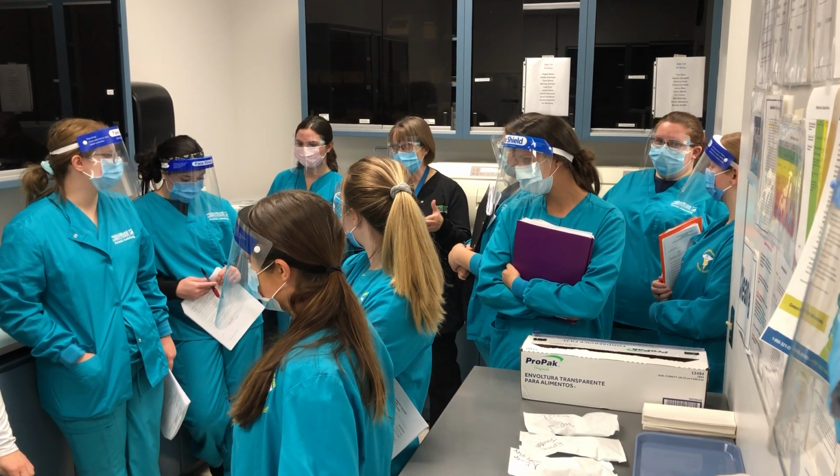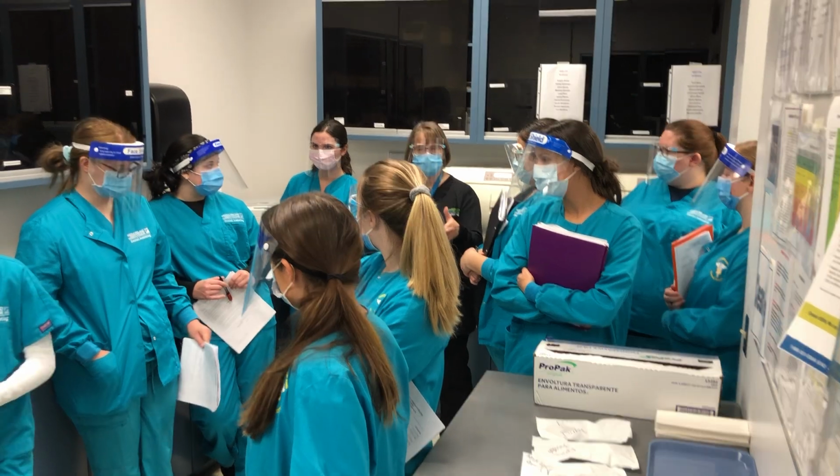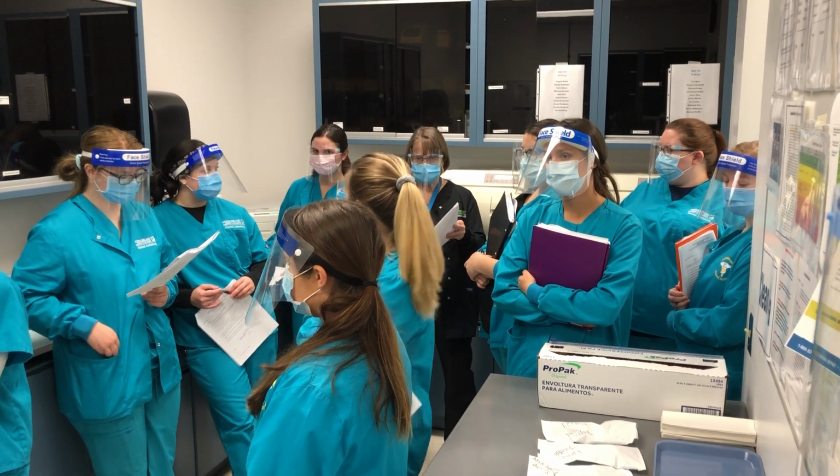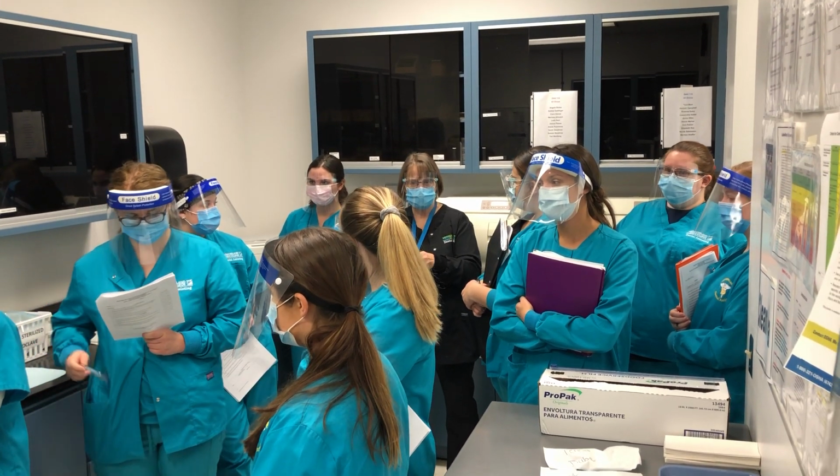So that's what's ideal, is if your office has large cassettes, you wouldn't be doing the separate bagging. But we want you to practice the bagging as much as the cassettes, so that's why we have it this way.